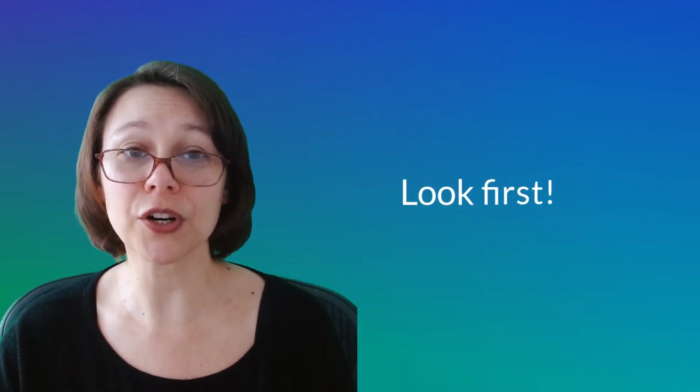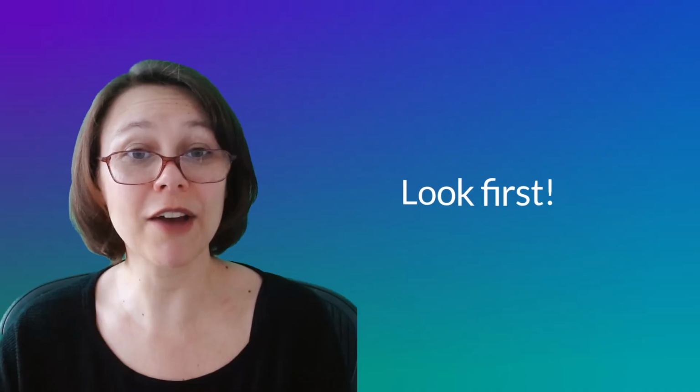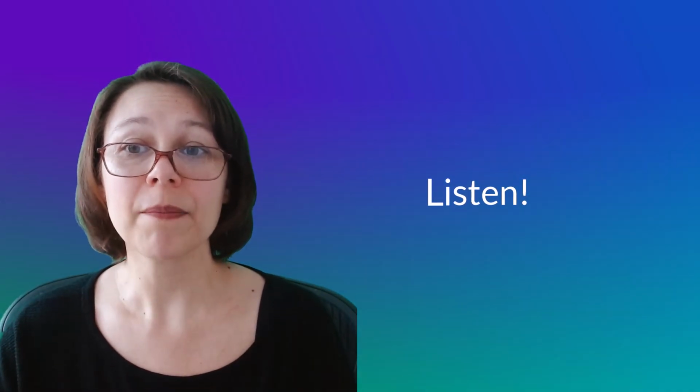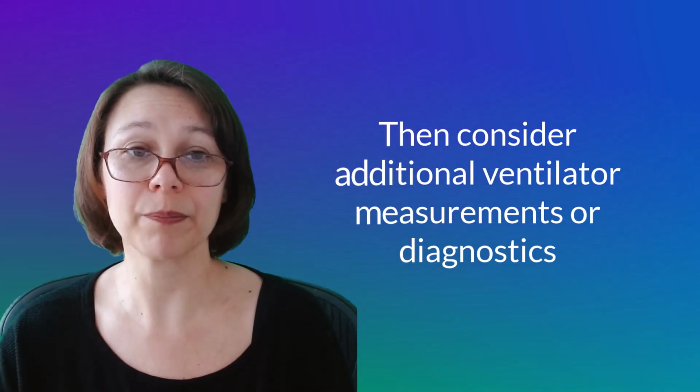It may seem overwhelming with all of the possible causes, but remember, if you're performing a good patient assessment, you should be able to identify the cause based on that. Remember to look first. Look at the patient, look at the monitor, look at the circuit, look at the graphics, then listen. Breath sounds can tell you a lot. Then consider any additional ventilator measurements or diagnostics that might be needed.